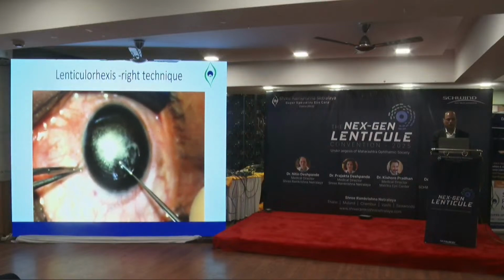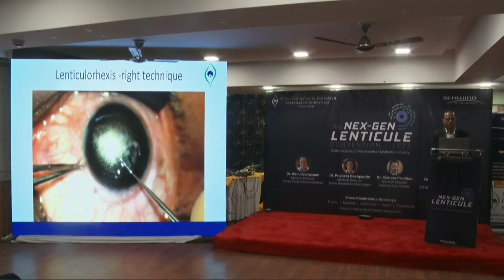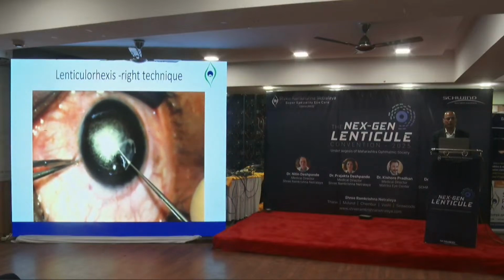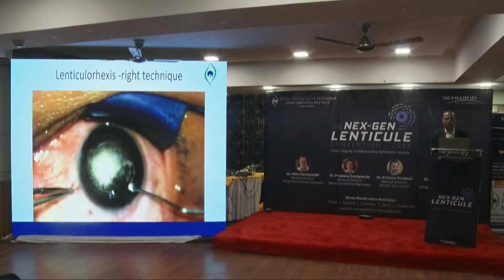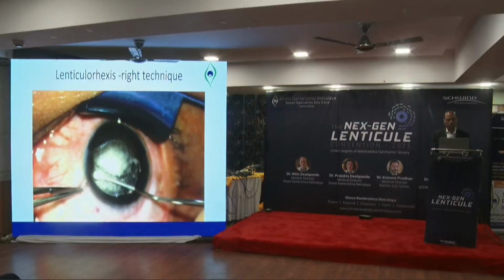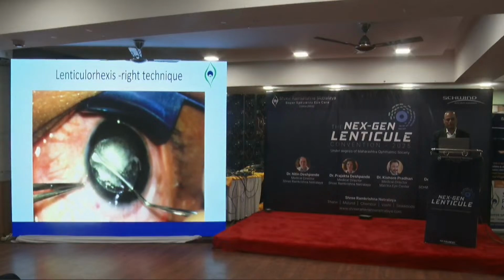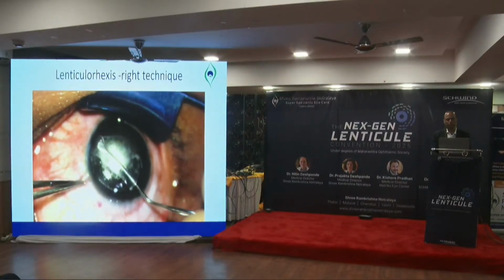So you can see that now the posterior plane is being dissected, and again the anterior one, to make sure that you are in the right plane. So this is a double, it's like check and check again. You dissect, a little bit of resistance here, but you still manage to go all through.